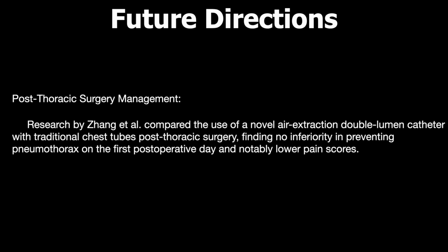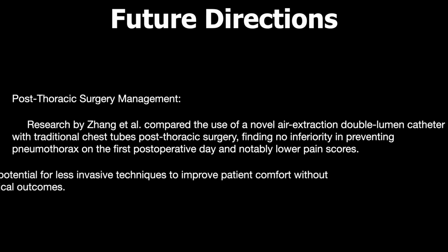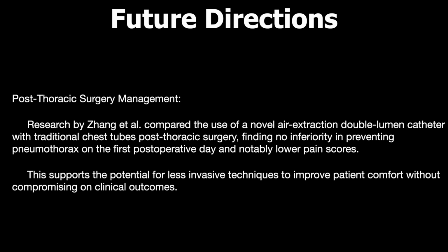Now, post-thoracic surgery. Zhang et al. compared the use of novel air extraction double lumen catheters with traditional chest tubes post-thoracic surgery, finding no inferiority in preventing pneumothorax on the first post-operative day, and notably, lower pain scores. This supports the potential of less invasive techniques to improve patient comfort without compromising the clinical outcomes.